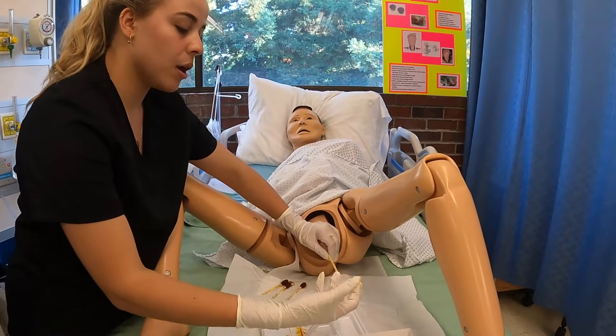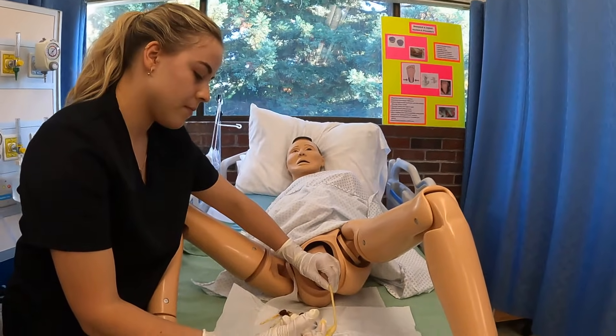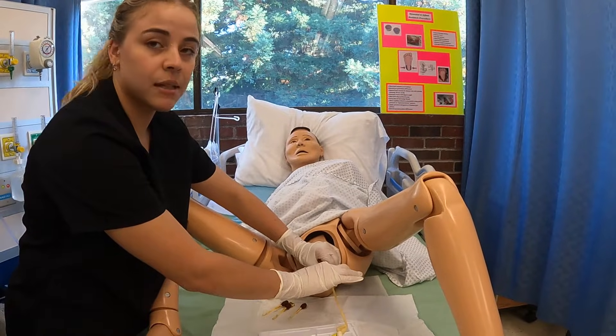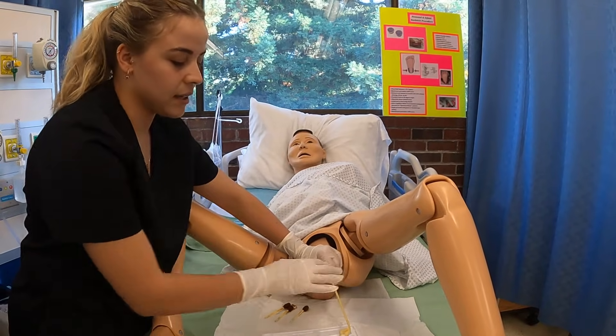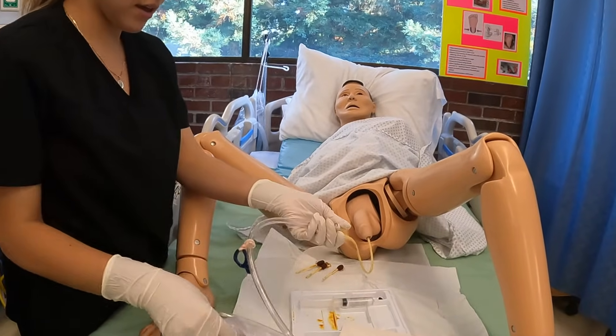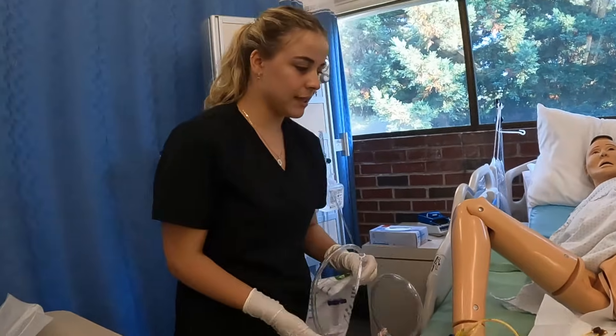From here, I would blow up the balloon — we have 10 cc's. Keep that in mind because that's what we need to document. Now we want to tug on it to make sure the balloon is fully inflated, and yes, it is. So now we can remove that and hang it on the side of his bed.